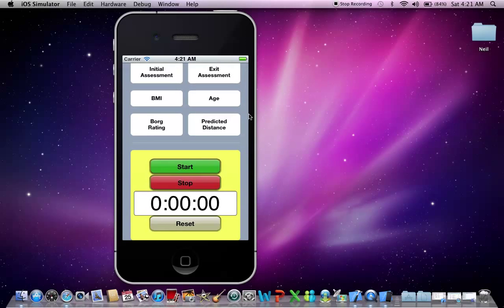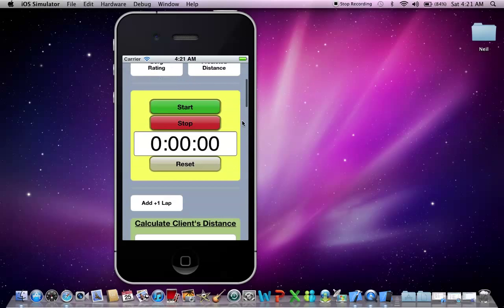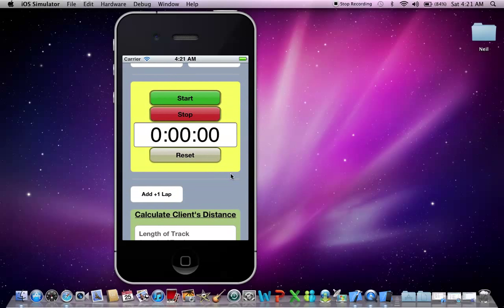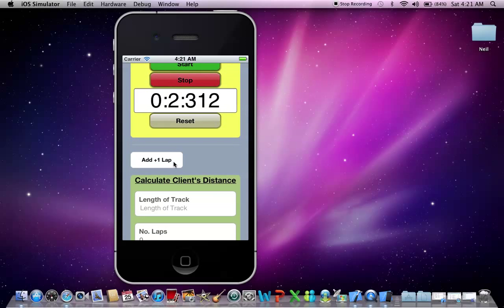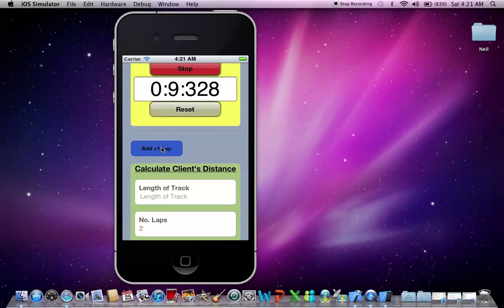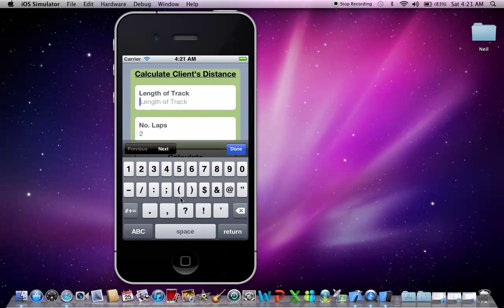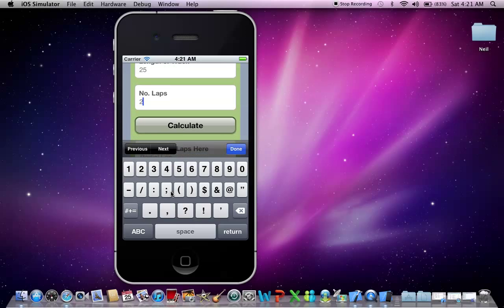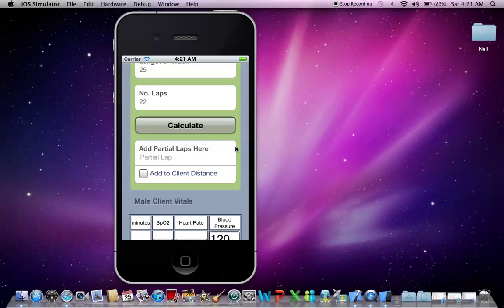Okay, now what I'm also going to do is, let's start the stopwatch. Okay, so what you can do now is add laps as you can see down there. Now to calculate a client's distance, you'll need to put in your length of track. I'm going to use 25 meters as an example. Now with your laps, you can also just type them in instead of using the lap counter. But I found the lap counter very handy when doing this test.